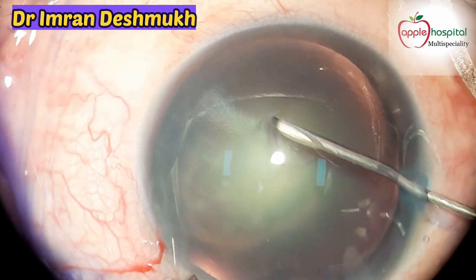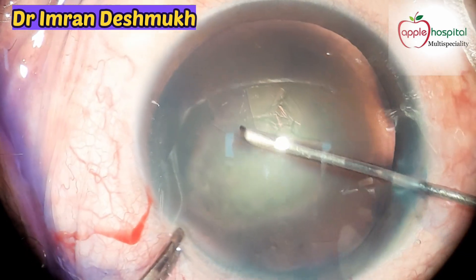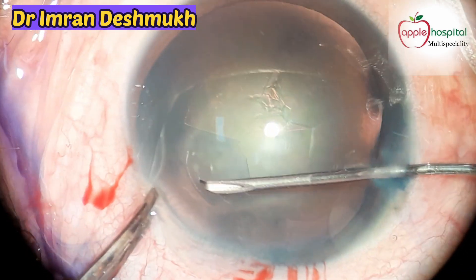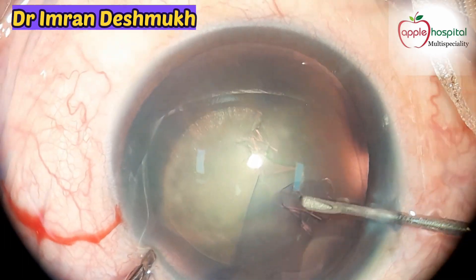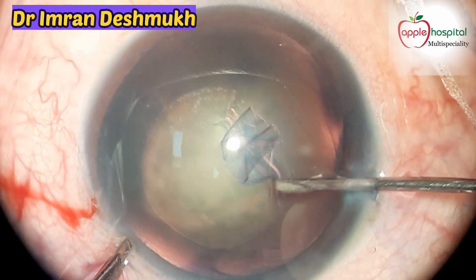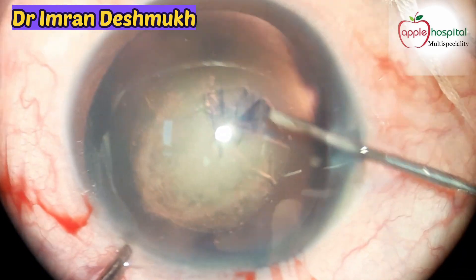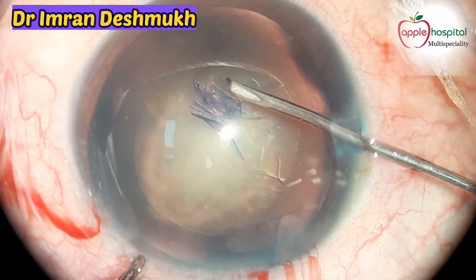I usually use a 26 gauge cystotome and enter through the side port. I avoid using the main port because that causes a lot of fluctuation in the anterior chamber. Now you can see a round circular 5 millimeter capsulorrhexis being made — it's going fine, going smooth.